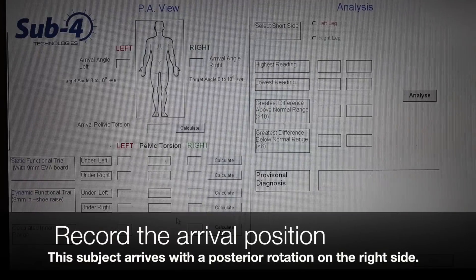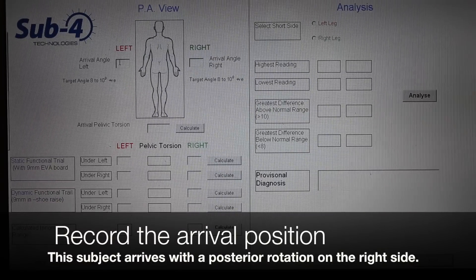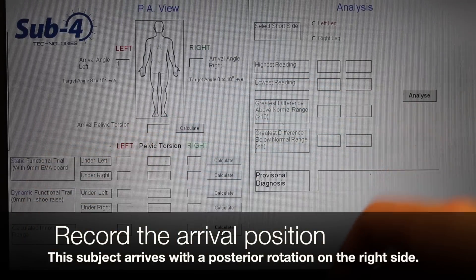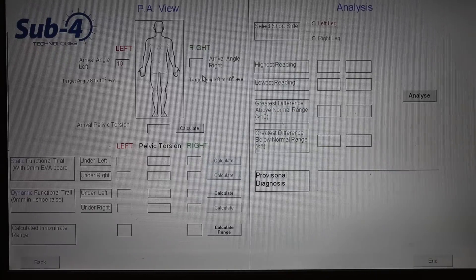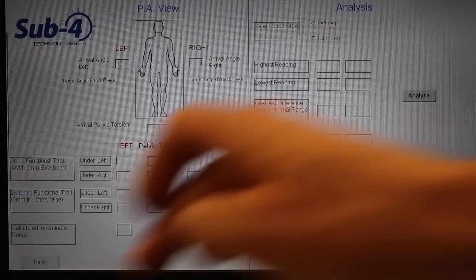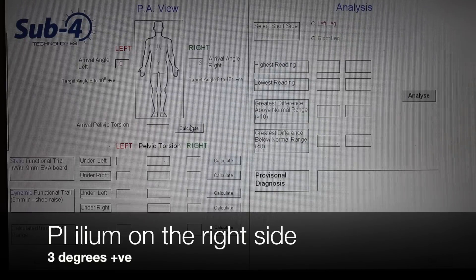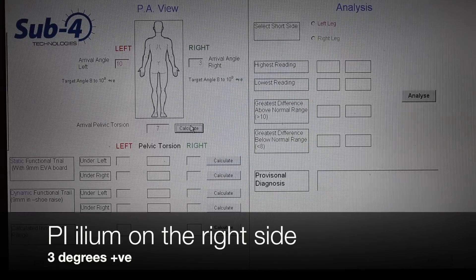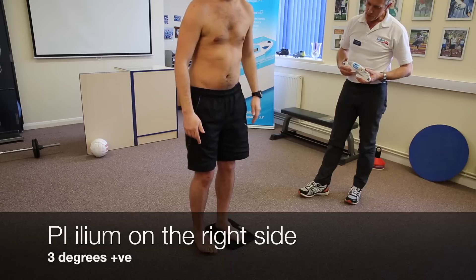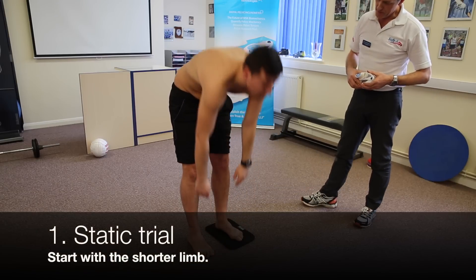We've measured his right side and his left side. These are his arrival numbers — to the clinic before we do any exercises, stretching, intervention, or treatment. He's arrived with 10 degrees positive on his left and 3 degrees positive on his right, giving us a 7 degree pelvic torsion. We're looking for normative values of about 8 to 10.